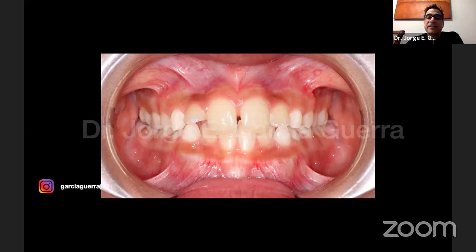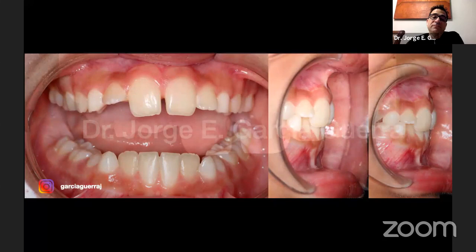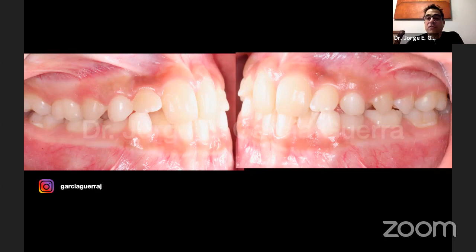So I sent this patient to do a CBCT. She had an inclination and very large, very beautiful teeth. But we can see that she's still in mixed dentition, and her canines were not erupting in the correct position. You can see the lateral incisor, and how proclined it is.